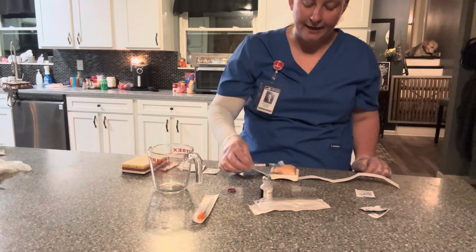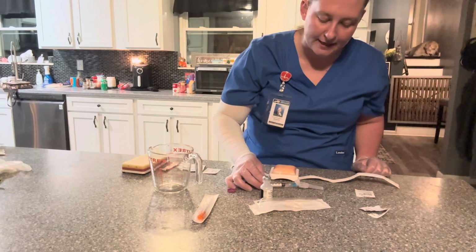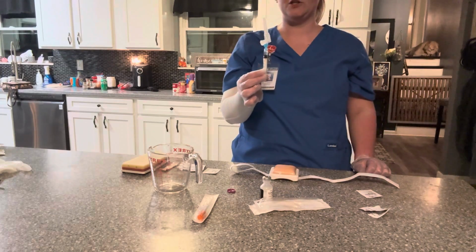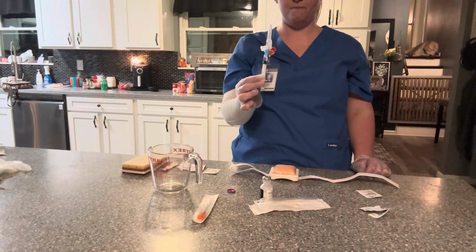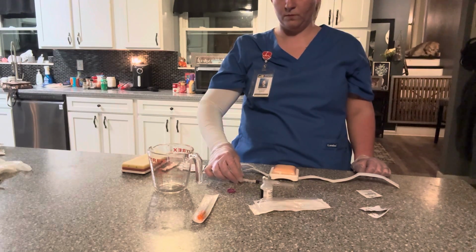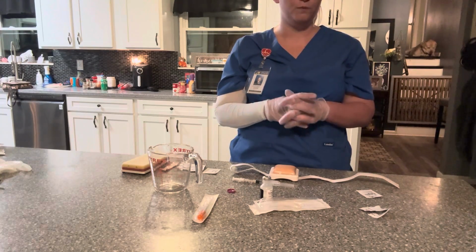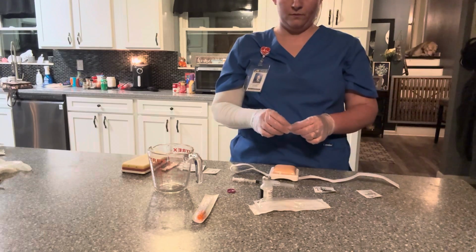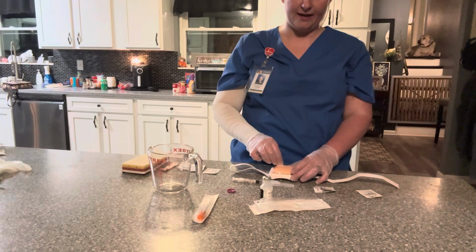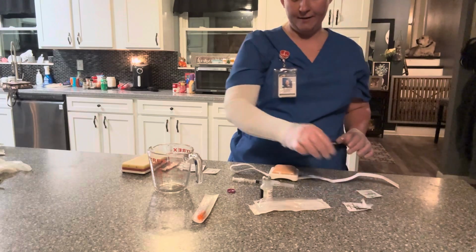I would never recap my needle. I would scoop the needle into the cap on the table for correct transportation of the medication, the needle, and the syringe. When giving a deltoid injection, this is usually given at a 90-degree angle. I will cleanse the patient's arm where the deltoid muscle is from the inner to outer area.